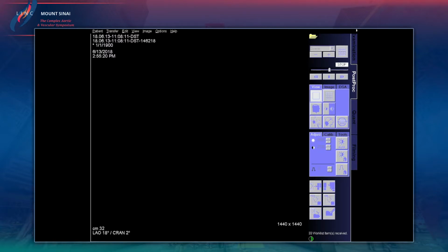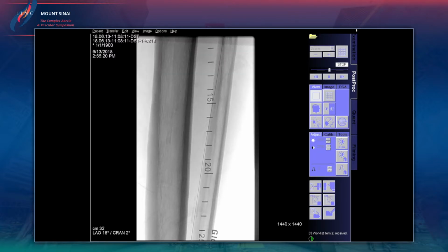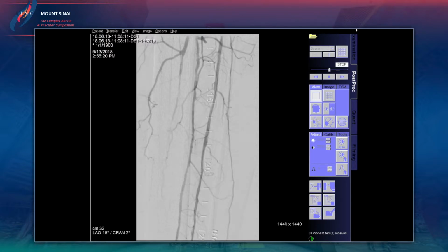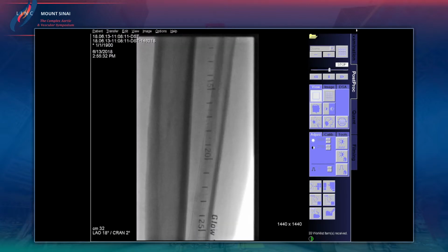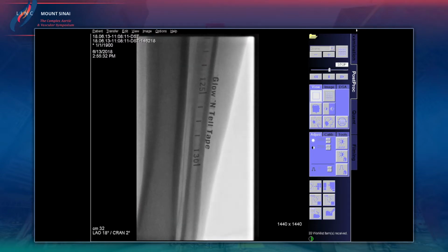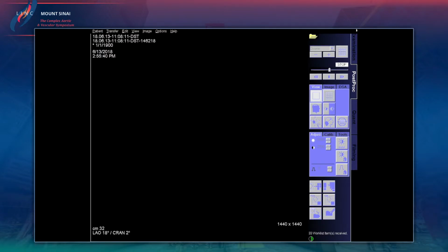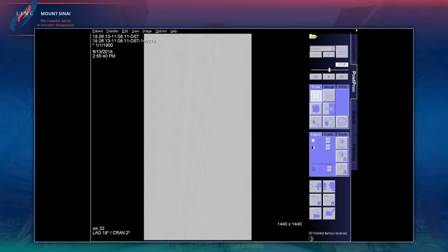I'm actually more worried about perforation in these kinds of repeat interventions, because of the actual flow. Now that's much better. But I really believe that debulking does help us in terms of getting patency. Jim McKinsey's data from the DEFINITIVE LE series is probably some of the most compelling data below the knee outside the DES, even though it's registry data and it's not a randomized controlled study.